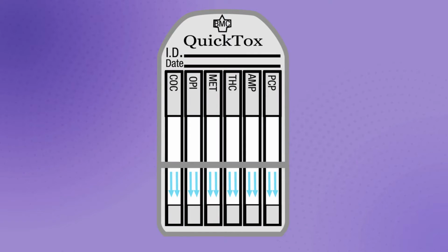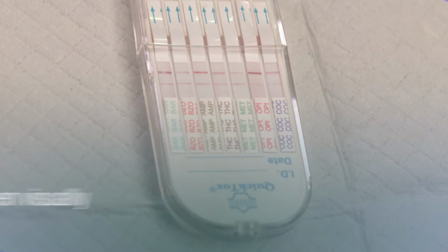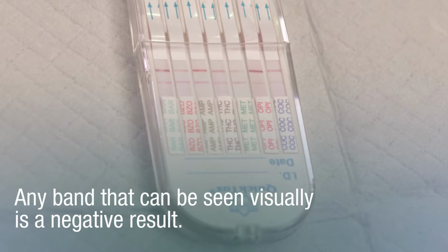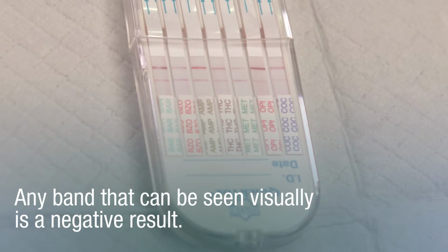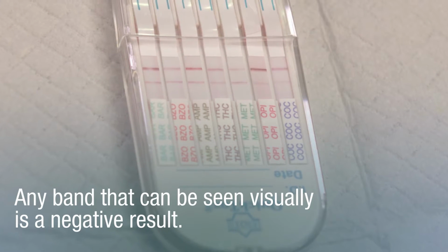And now what you have been waiting for, finally the interpretation of results. For each drug test, 2 colored bands should be observed in the result window. One band at the control region, C, and a band at the specific test region, T. The color of the test band may be slightly darker or lighter than the control band. Any band that can be seen visually, no matter how faint, is a negative result. Read each test independently. Do not compare color intensity of one strip to another.